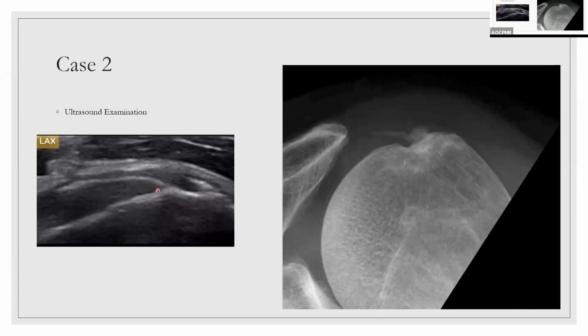It's a sign of remote trauma to a tendon. Like anything else, after a remote trauma, you can have calcifications develop. So this was the body's attempt to heal a prior tear, and it did its best, and it was left with some calcifications. And these are painful. With these needles sticking into the tendons, you can see how it can quickly become an impingement underneath the acromion, because this isn't just some flexible tendon. This is all out a needle of calcium.